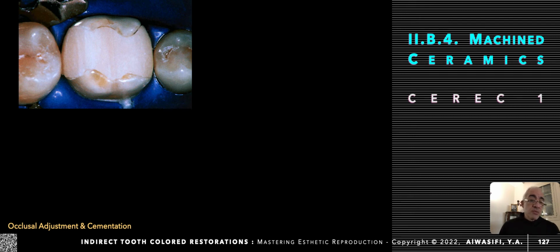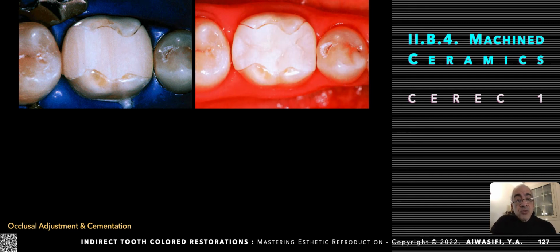This is because the resolution was not satisfactory at this time, and because of this marginal inaccuracy, and the difficulty to reproduce the anatomy by hand carving using specific cutting rotary tools at this critical area, sometimes your restoration rocked in place, sometimes there will not be enough water coolant, and the restoration is fragmented and the procedure is repeated again and again.